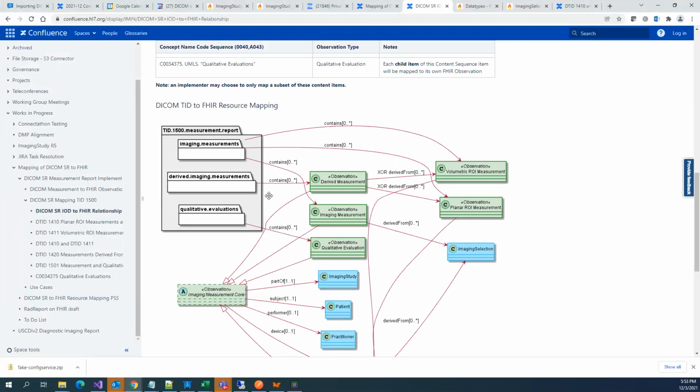So what we will do, Venu and others, we have left with only almost a week. Next week we will be already in this. So what we'll do is we'll start this. We'll put this Excel sheet in Google Drive, and we'll start mapping. We'll put this mapping in there actually, and we'll ask people to already start creating these templates, and you can already start seeing how your DICOM SR is getting into observation actually.